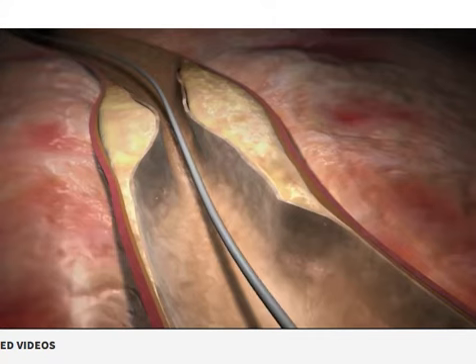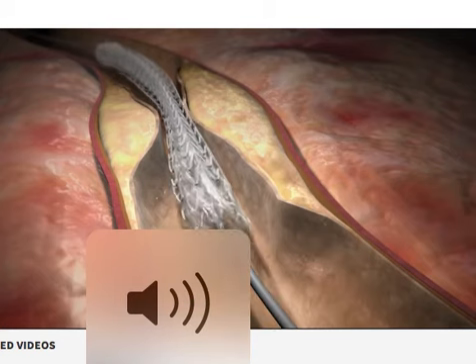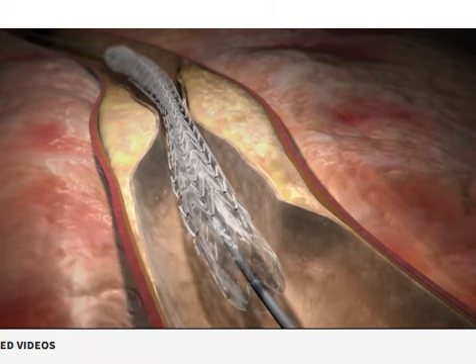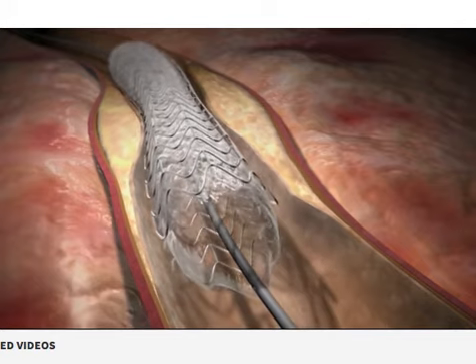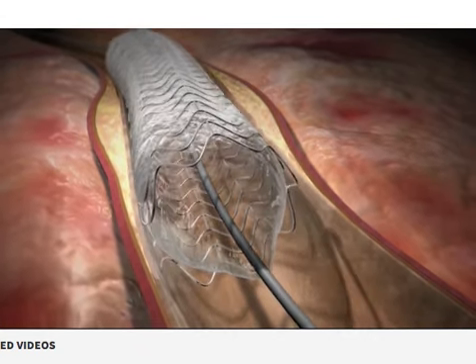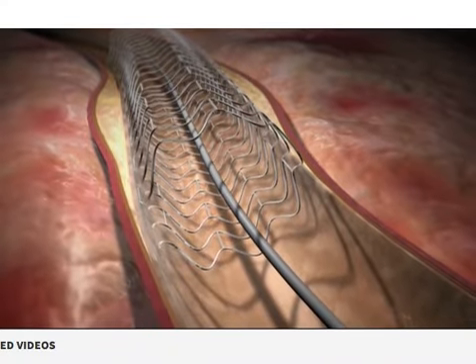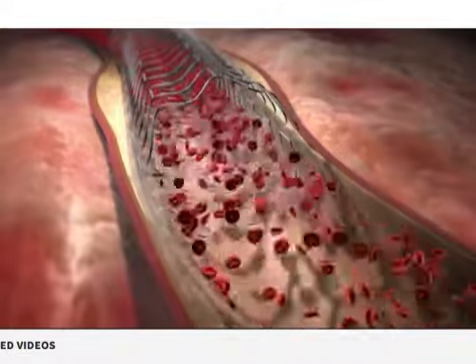Then she'll thread a catheter over the wire. The catheter has a balloon on the end, surrounded by an expandable mesh tube or stent. She'll gently guide it to the narrowed part of the artery and inflate the balloon, which will press against the sides of the artery. The inflated balloon will then lock the stent into place, so it will stay open and let blood flow freely again. The catheter will then be removed and your doctor will stitch up the skin where it was inserted.